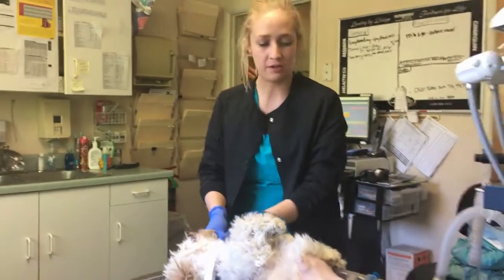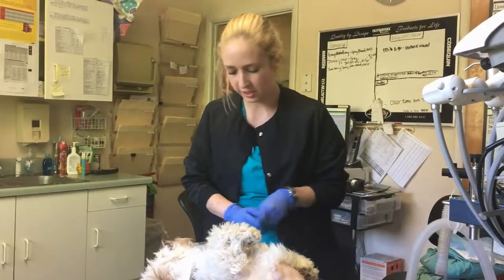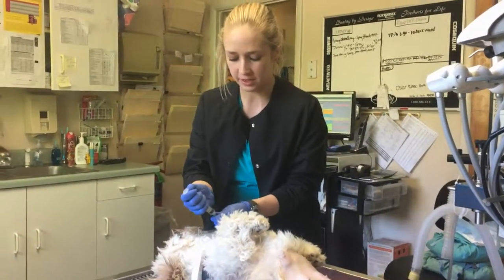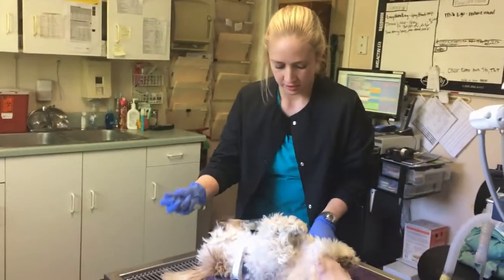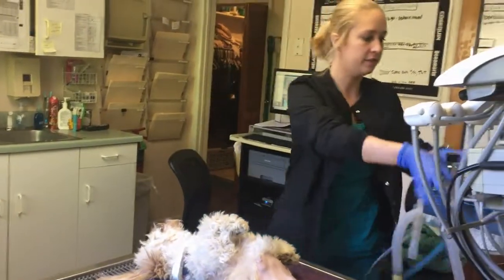Okay, now that I've got her clipped and scrubbed, I can go ahead and transport her to the operating room. So the first thing I'm going to do is go ahead and deflate the cuff. And I will detach her from the anesthesia.